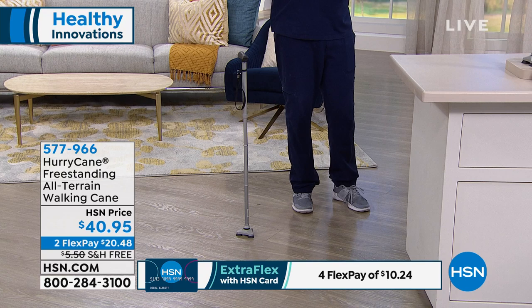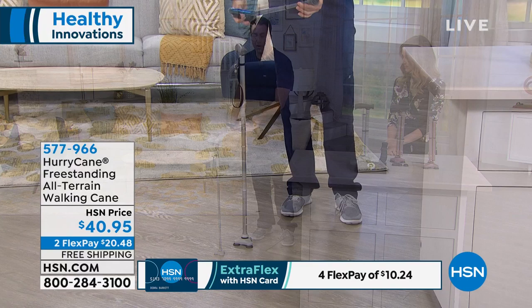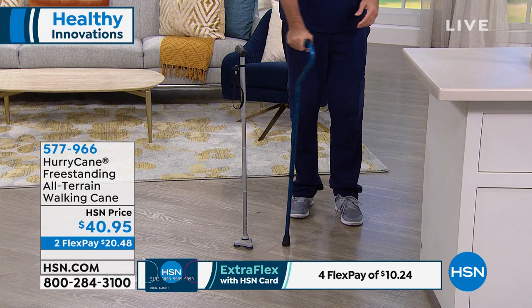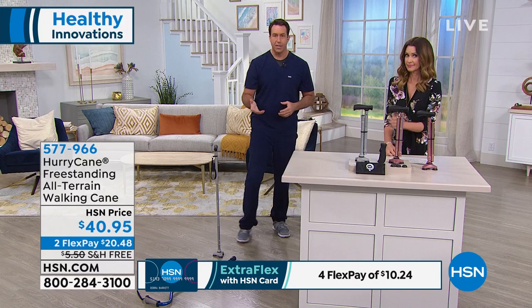I brought my dad's old cane. This is the one-size-fits-all — I call it the clunker. It has one point of contact, so only one point of safety on the ground. Not much stability, not much support — a little wobbly, a little rickety. And the thing my dad mentioned is that dropping your assistive device or your cane can be a nightmare because you don't know what to do.